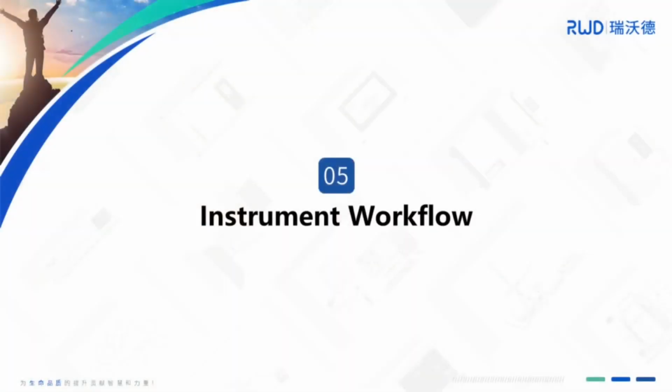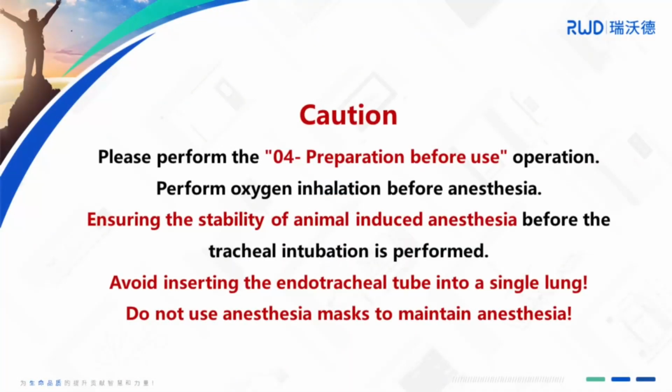Instrument workflow. Please perform the preparation before use operation. Perform oxygen inhalation before anesthesia, ensuring the stability of animal-induced anesthesia before tracheal intubation is performed. Avoid inserting the endotracheal tube into a single lung. Do not use anesthesia masks to maintain anesthesia.